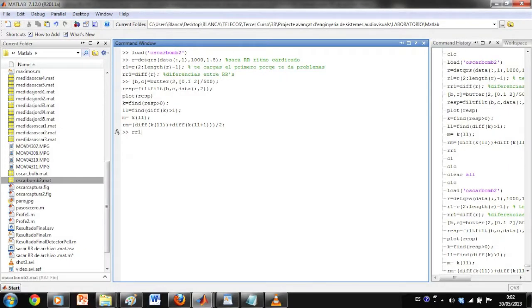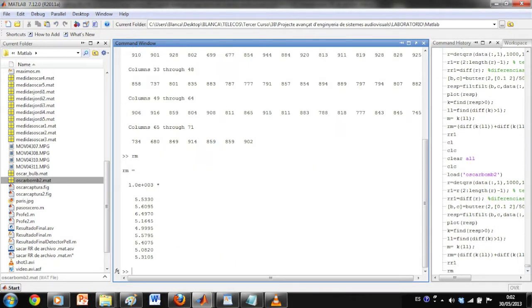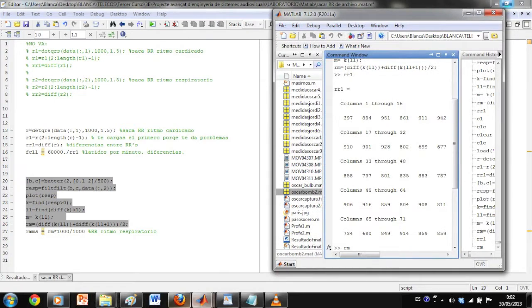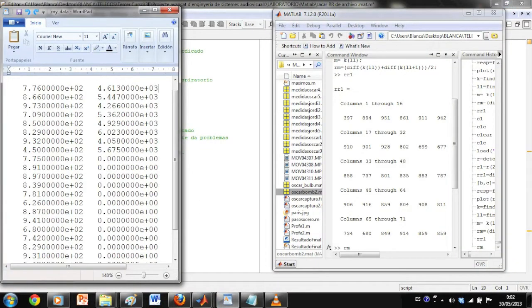Now, we are going to check if our system takes the same values as the BioPAC. First, we load the values of the BioPAC and process them with MATLAB. Next, we look for the values that we have obtained with our system and compare them with the BioPAC ones.